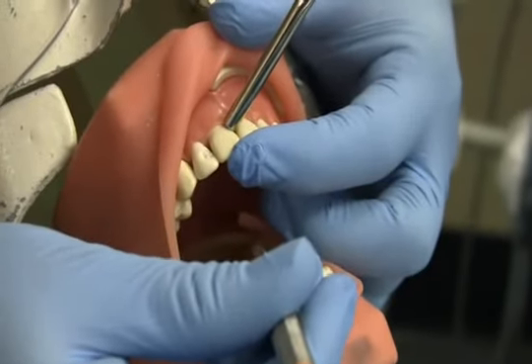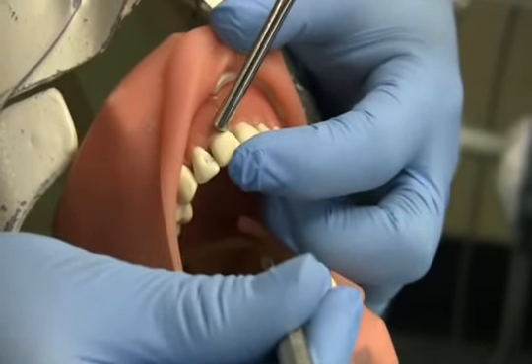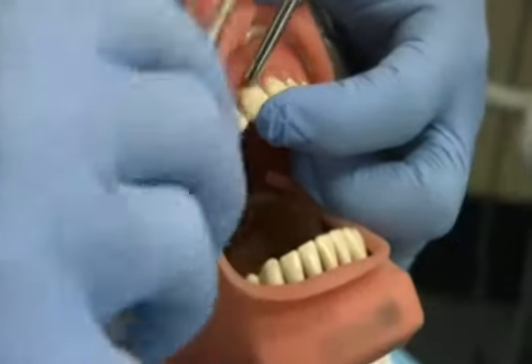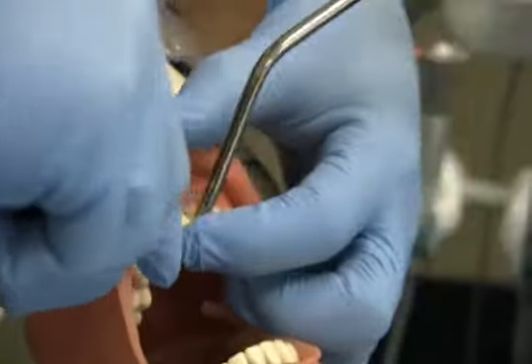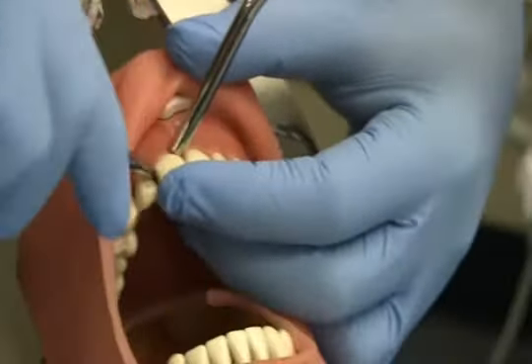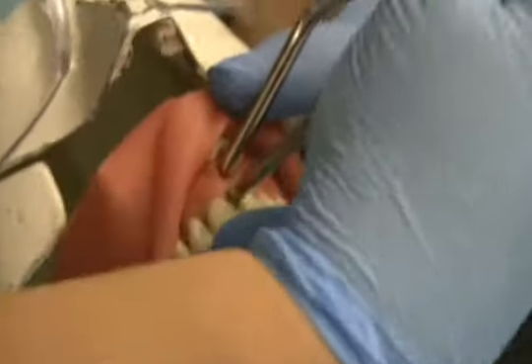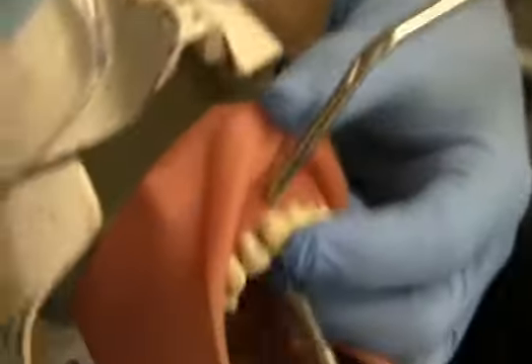The dental assistant will then pass the tooth elevator. The dentist will then attempt to loosen or elevate the tooth. We would then pass the appropriate forceps.